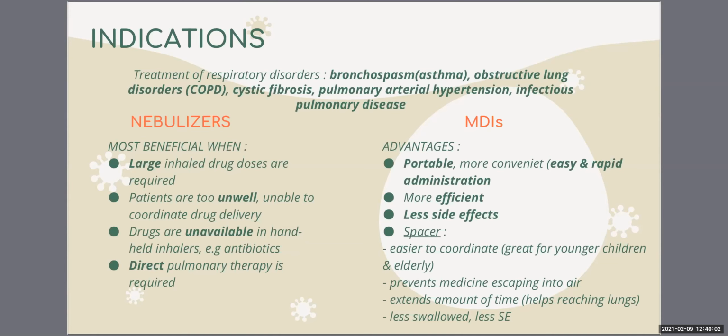And for MDI, these are some of the advantages: it is more portable and more convenient, easy and rapid administration, more efficient, and has fewer side effects. As I mentioned just now, MDI is usually used together with a spacer. It is easier to coordinate, which is great for younger children and the elderly.